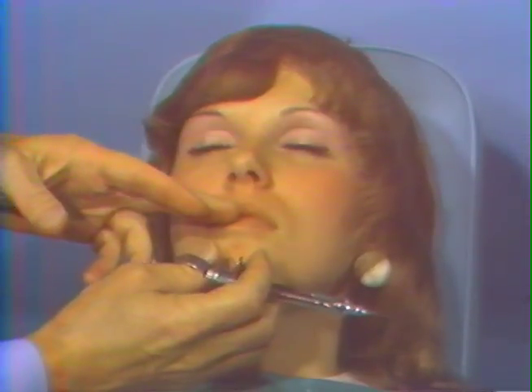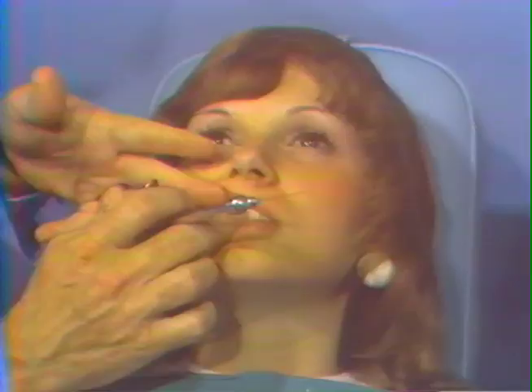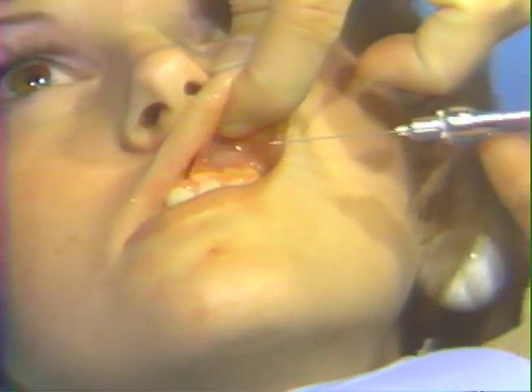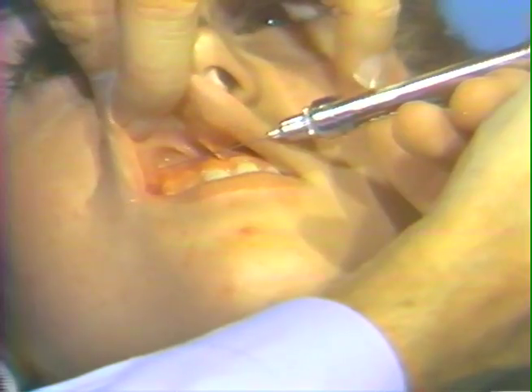If it is the opposite, if anesthesia is desired on the right side of the anterior maxilla, it may be placed in this manner here. Turn your head towards me, open a little bit wider. Retracting the lip with the finger and thumb, passing this from the opposite side in a horizontal direction to lie in this position here.